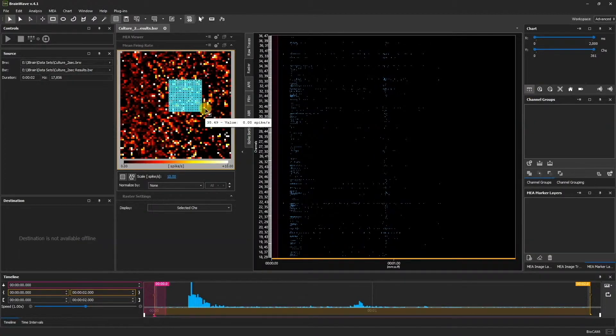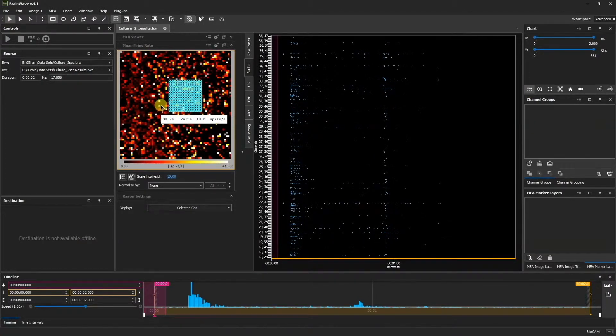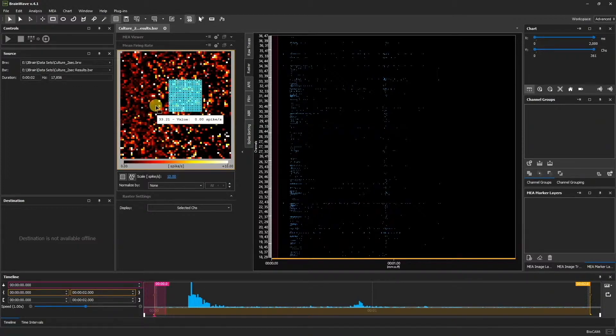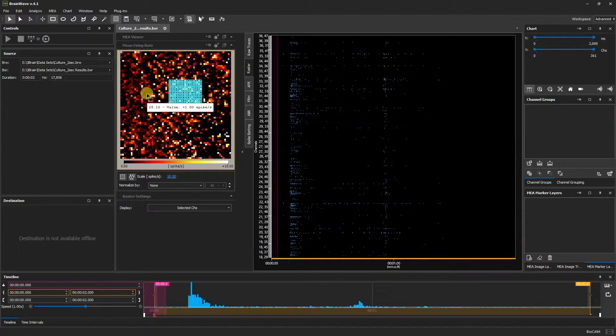Meanwhile, on the left, the color mapper represents the mean firing rate. By hovering over different channels, we can see the average spikes detected per second per channel over the time frame of the recording.